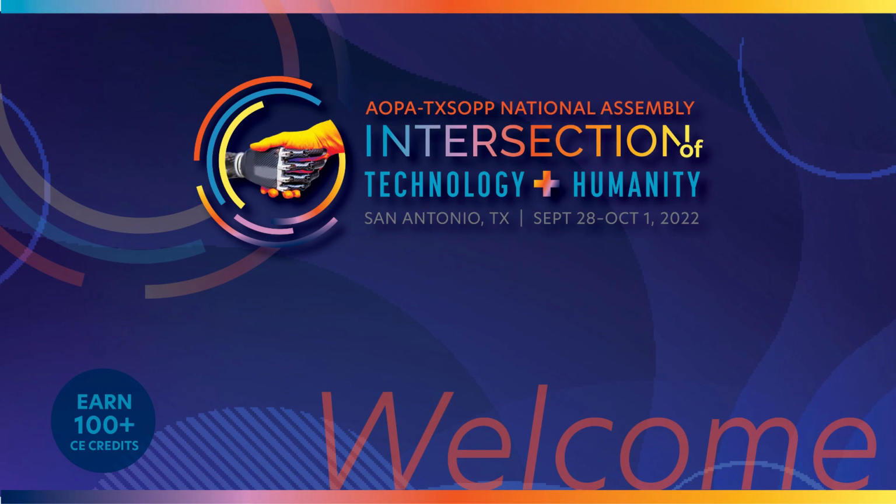We have a consultation with a hip replacement specialist that works with the limb restoration program, who's accustomed to dealing with more complicated situations, and we will plan the implant accordingly. So leave room. There are resurfacing options. There are also options where if we leave enough room, they can get a custom implant designed for the hip replacement. Thank you.